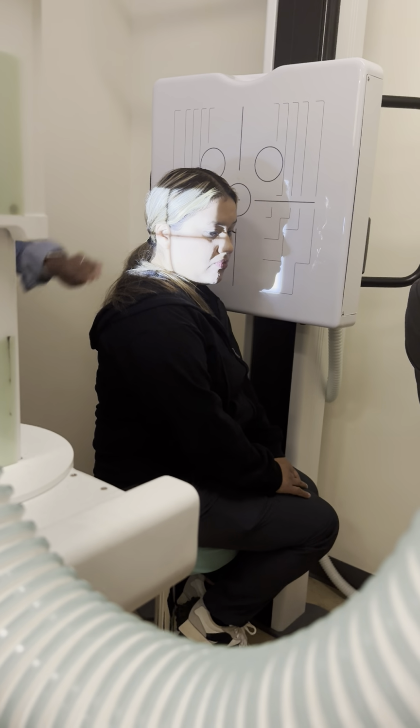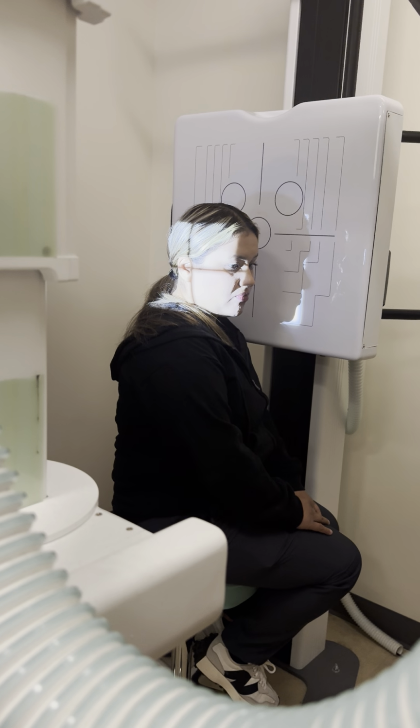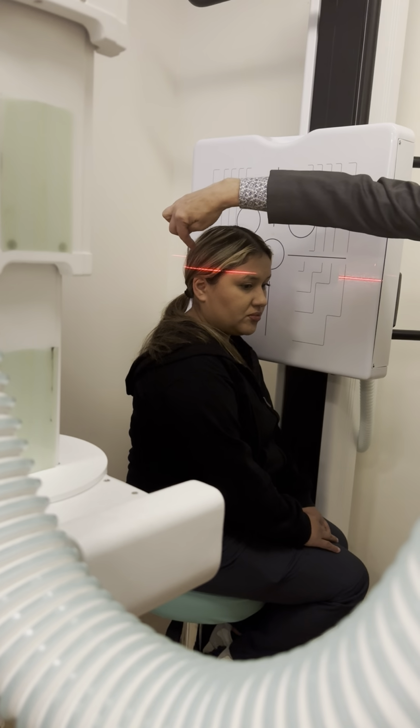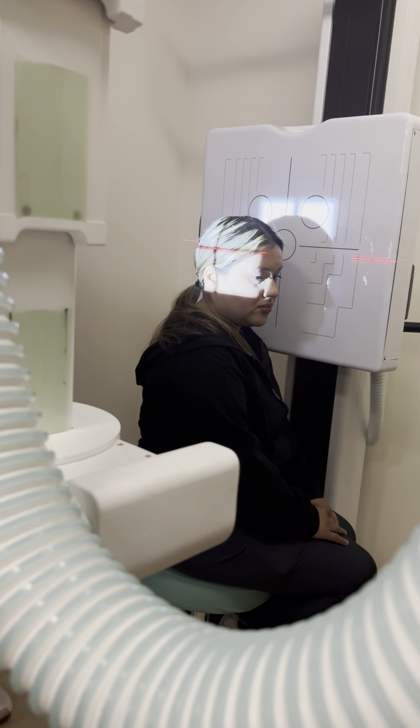I have a skull, a lateral skull. For some people, they need to see this, then they come up 2 inches. That's what I'm showing you. Come straight up to the ear. 2 inches above the EAM makes for a lateral skull. I think that's probably where the confusion is.